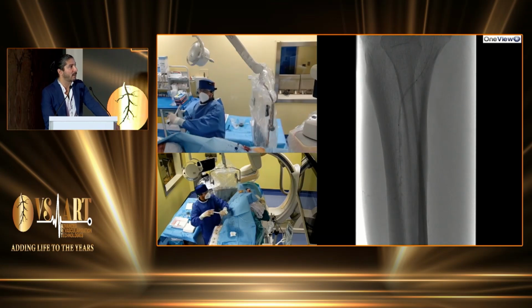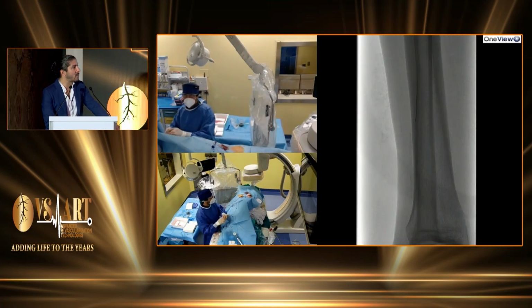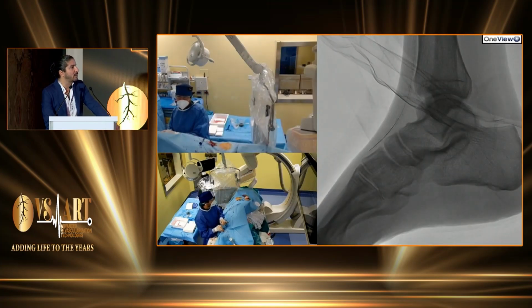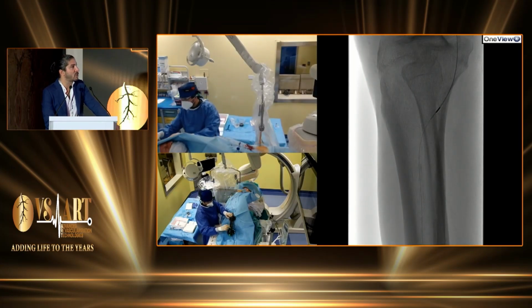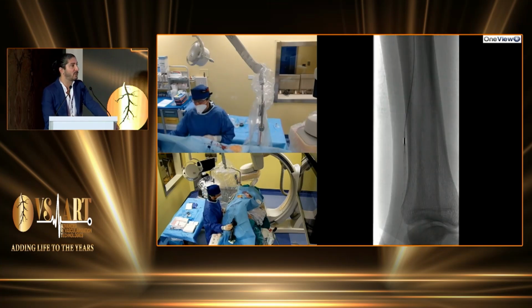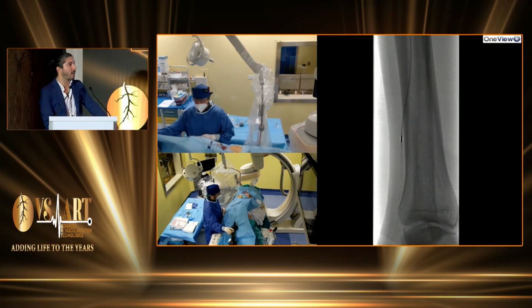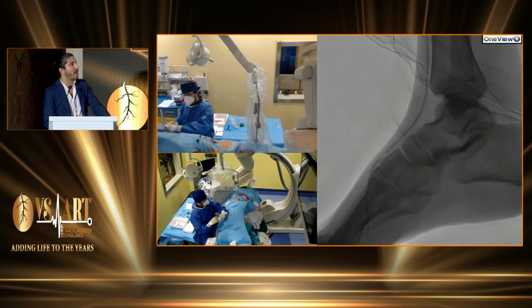So we decided suddenly to shift to orbital atherectomy. That is another tool to fight against calcium. Shift to a Viper wire that navigated pretty well till the foot, and we started with a 1.25 solid crown to treat all the anterior tibial as well as the dorsalis pedis. Again, when we talk about technologies to treat below the knee and below the ankle, it's important to evaluate how far away we can go with these new devices. And again, this is another excellent example about the options, the possibility to treat the distal vessels with orbital atherectomy.